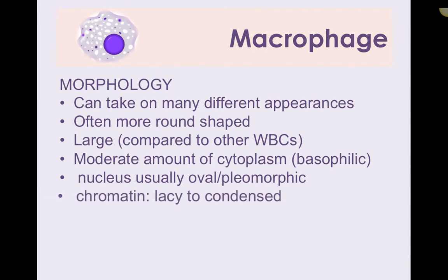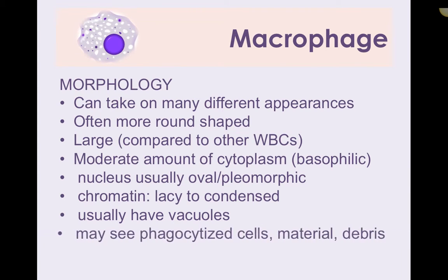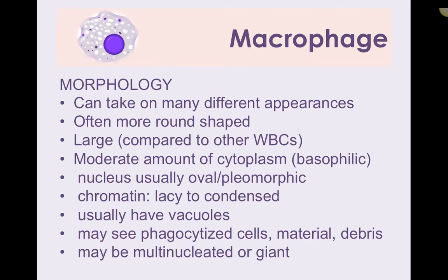Macrophages can take on many different appearances — often round, oval, or slightly irregular in shape. They tend to be quite large compared to most white blood cells, though sometimes they're the same size as a monocyte or neutrophil. They have a moderate amount of cytoplasm that is most often basophilic — taking on a purple appearance. The nucleus is usually oval or slightly pleomorphic, chromatin is lacy to condensed, and they often have vacuoles. They may be phagocytizing material or debris and can be multinucleated.